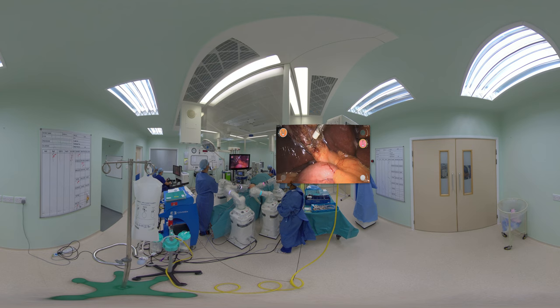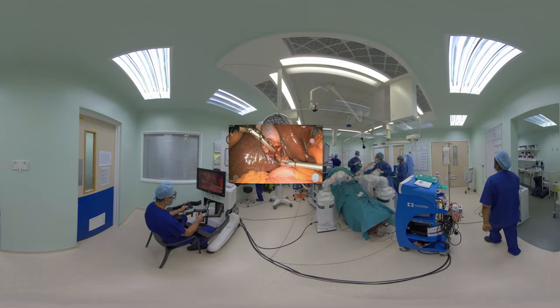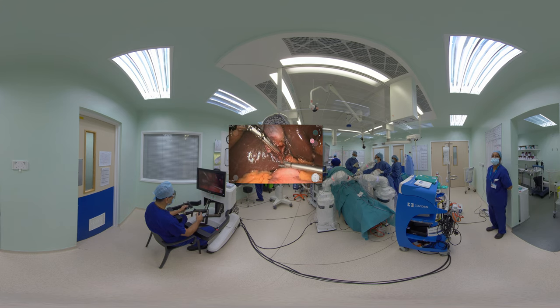Once the cystic duct and artery are clearly identified and a critical view of safety behind these structures is achieved, we then apply the Ligaclips first to the cystic duct and then to the cystic artery.